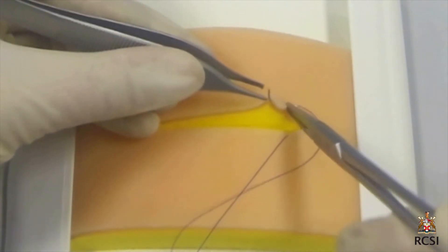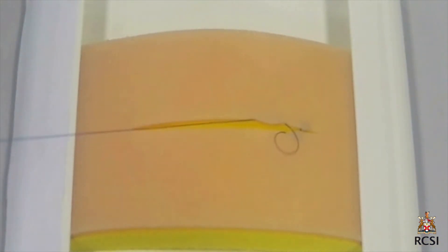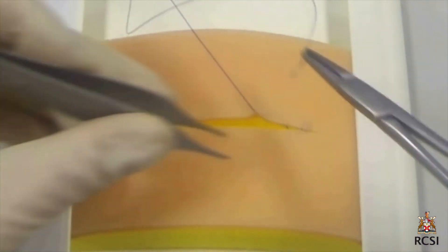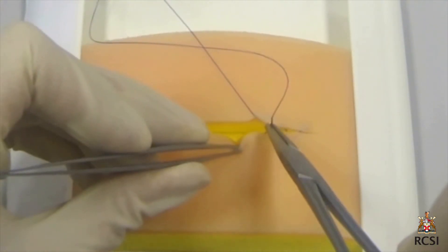Care is taken to use the forceps in a gentle manner on the skin edges. This suture can be done by the lone surgeon, but it may help if an assistant is available to hold the long ends of the suture out of the way while each bite is taken.